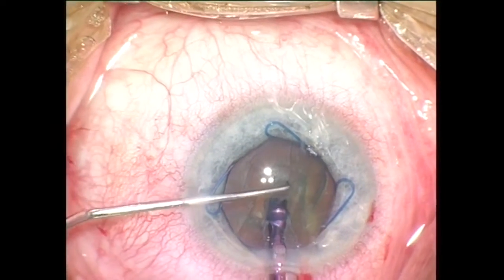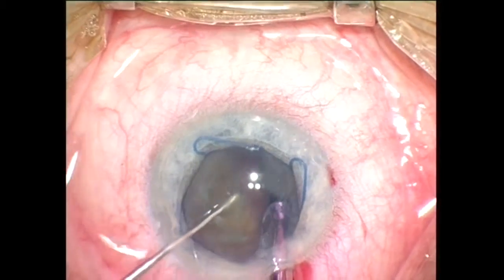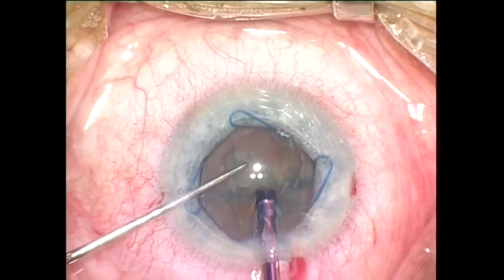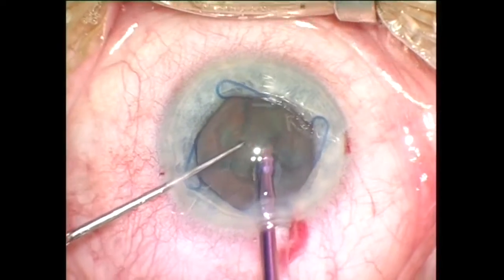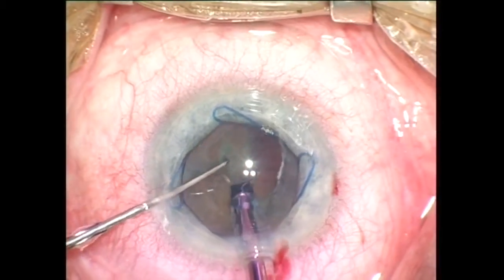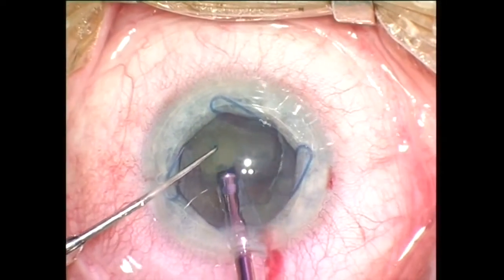The ultrasonic needle is embedded into the nucleus and the chopper is used to make the first crack. Then the nucleus is rotated and fixated with high vacuum settings. The nucleus is chopped again and quadrants evacuated with high vacuum settings. There is no billowing or prolapsing of the iris, which is very stable during these manipulations.